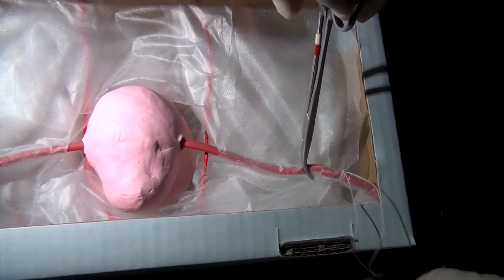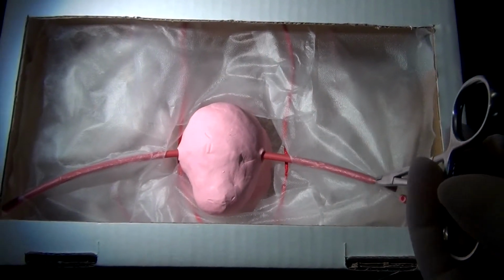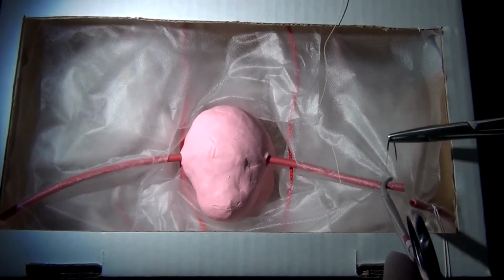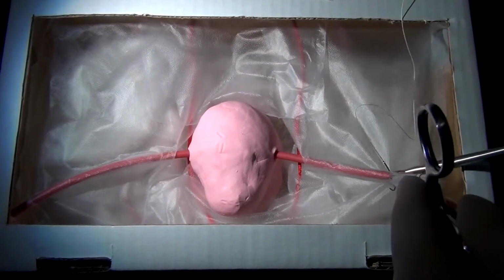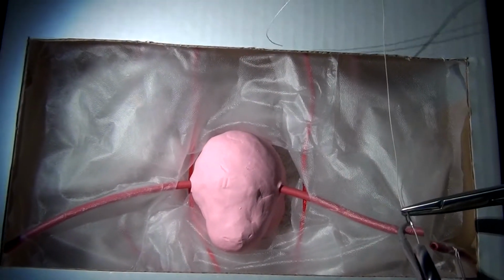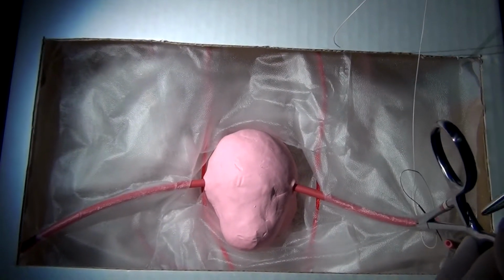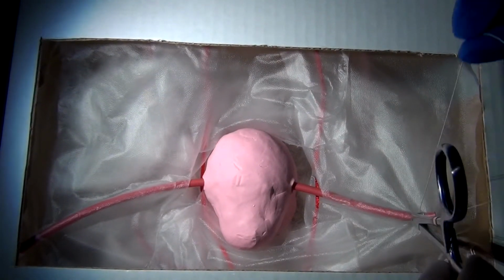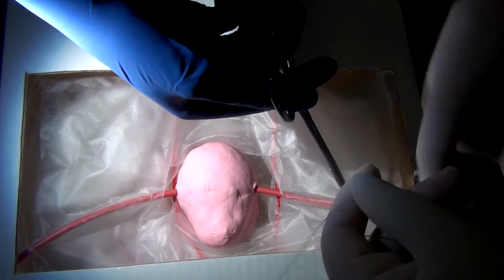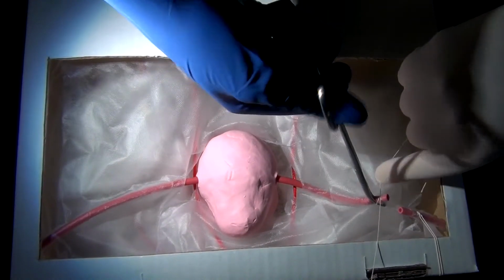Some people, particularly when doing a hysterectomy, may decide to just keep the clamp in place, but remember the artery of Sampson runs through the round ligament, so whether you clamp it or suture ligate it, you've got to do something. So I'm going to come underneath my round. I'm going to transfix this side so that I can get rid of this clamp. I don't really want to lock it. Thank you. Same thing, I'm going to do a nice surgical knot. Come off, thank you.